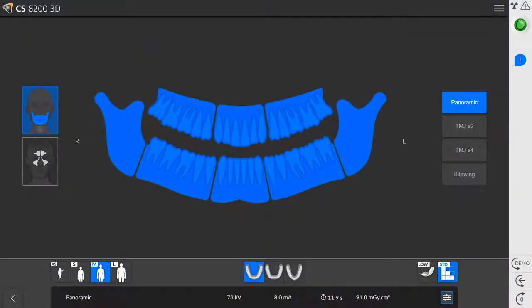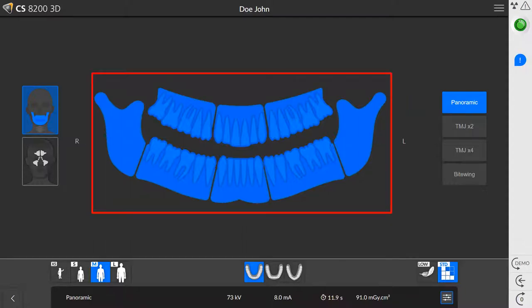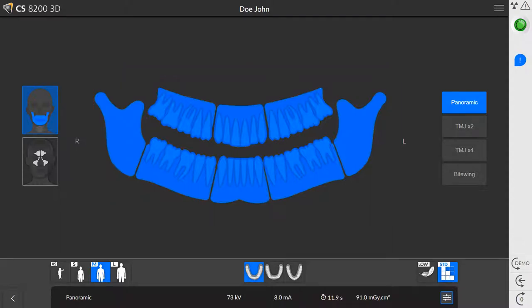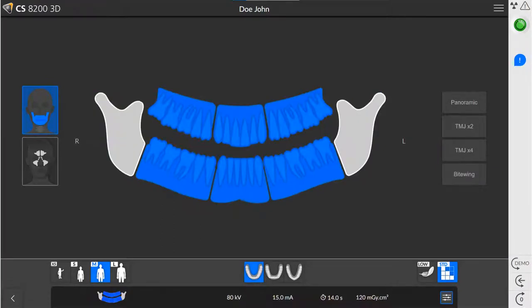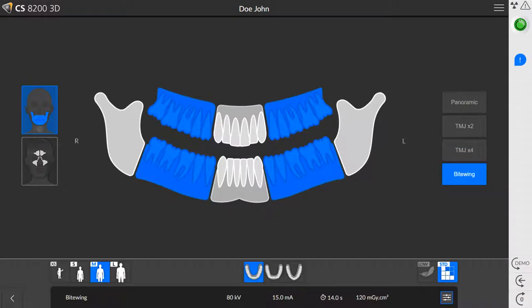You can choose between two programs: panoramic or sinus. To perform a panoramic exam, click panoramic and click the area you would like to examine. You can choose from several 2D exams: standard panoramic, TMJ times 2, TMJ times 4, panoramic without TMJ, and bite wing exam.